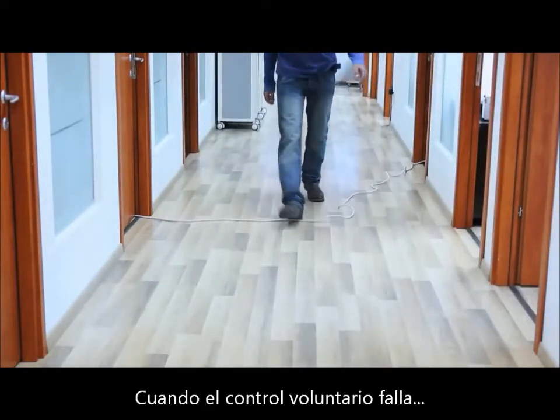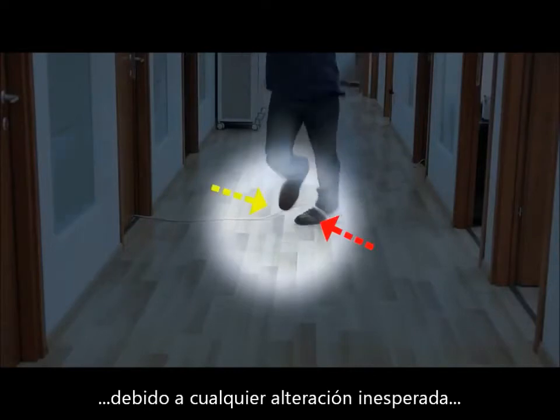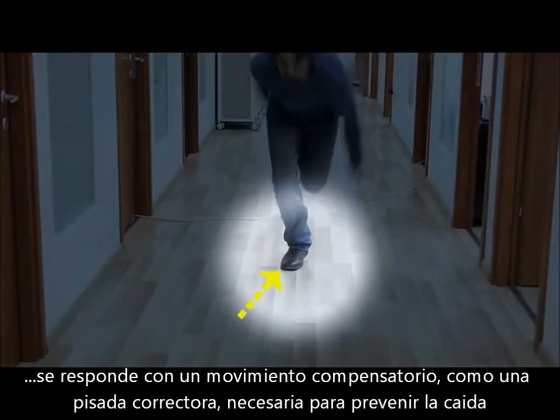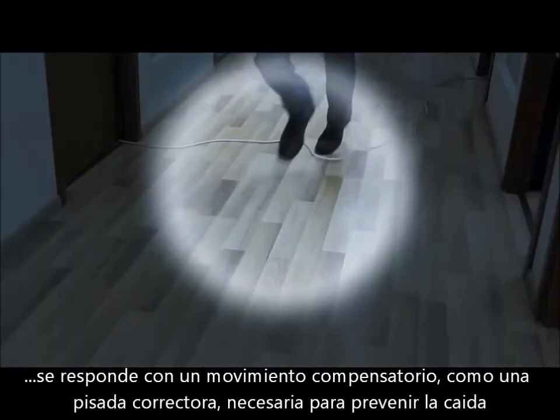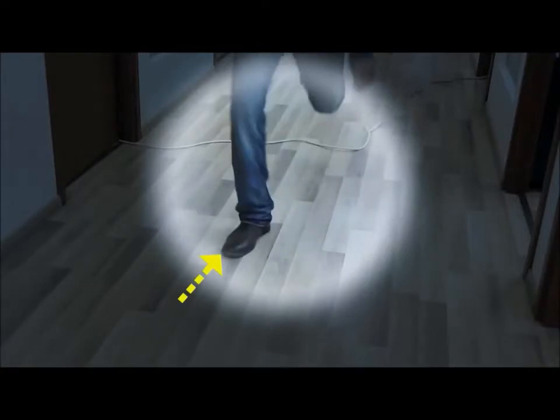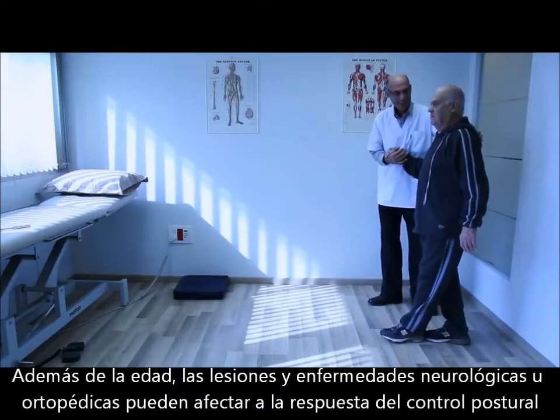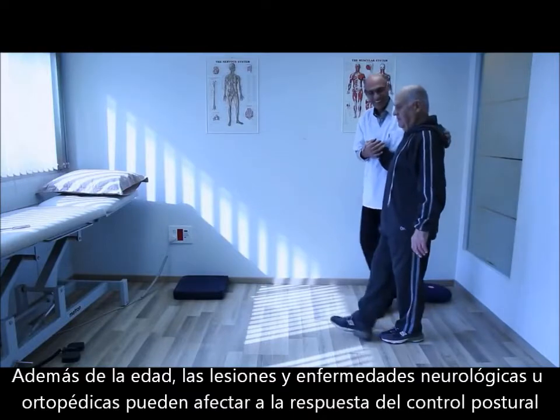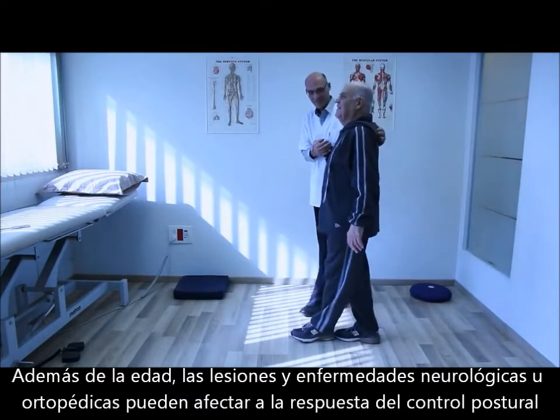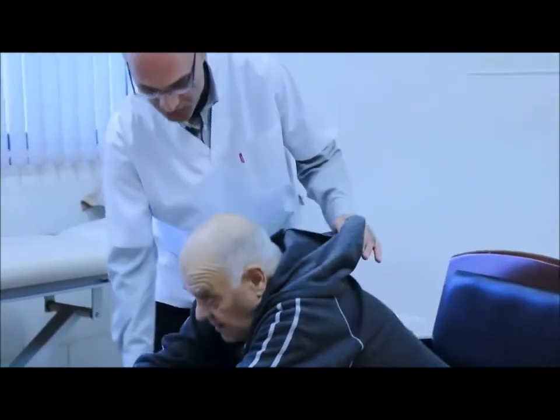When voluntary control fails because of an unexpected perturbation, a compensatory response, like a compensatory step, is needed to prevent a fall. In addition to aging, both neurological and orthopedic injury and disease may affect postural control responses.